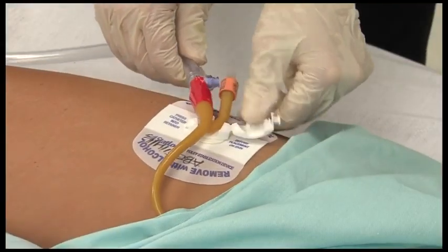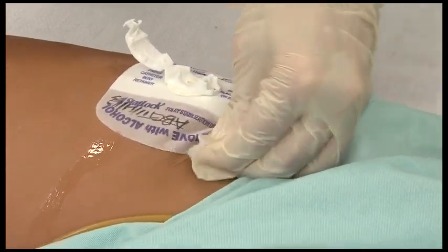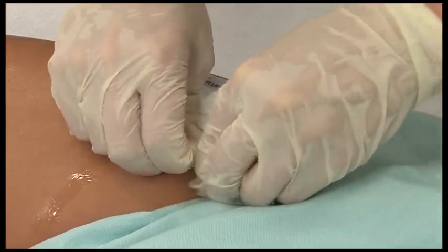When the patient no longer requires catheterization, remove the catheter in accordance with hospital policy and physician's orders. Remove the StatLock Foley stabilization device or other securement product prior to discontinuing the Foley catheter. Follow the device-specific instructions. You may now remove the Foley catheter.